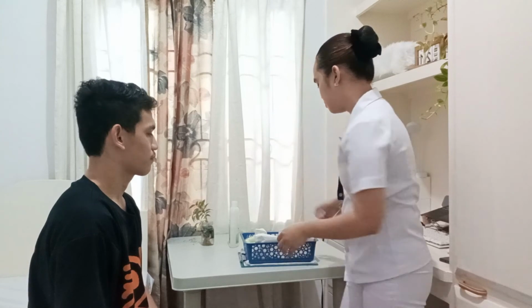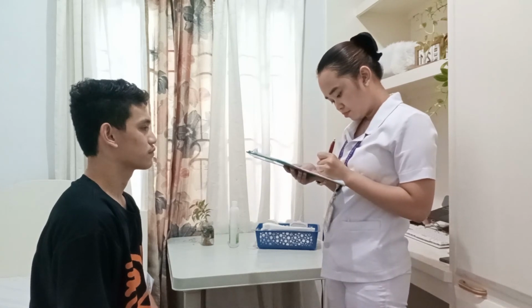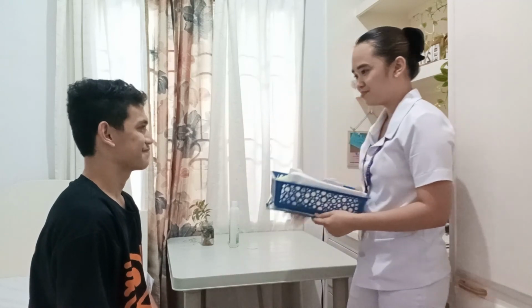Okay, now I'm going to document the oxygen saturation of my patient in his monitoring sheet. Okay, Mr. Patrick, thank you for your cooperation and have a nice day ahead. Thank you so much.